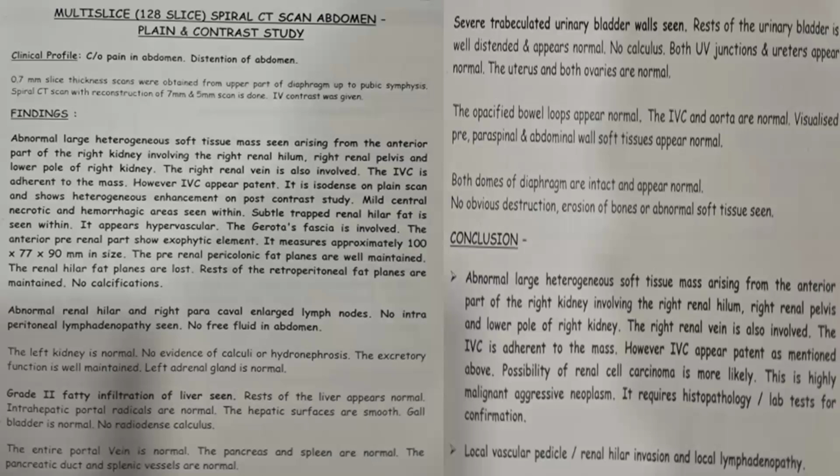So I think after this discussion, you should not have any confusion about doing the DTPA scan in such cases, and what should be the sequence of management when we have a contralateral stone and the same side renal mass. I think these two issues must be clear to you all. I think it has gone quite well.